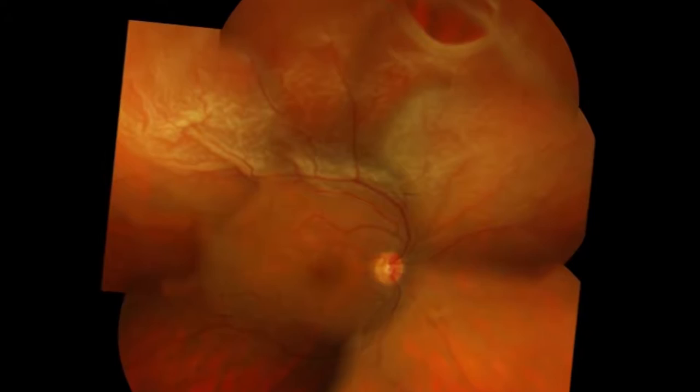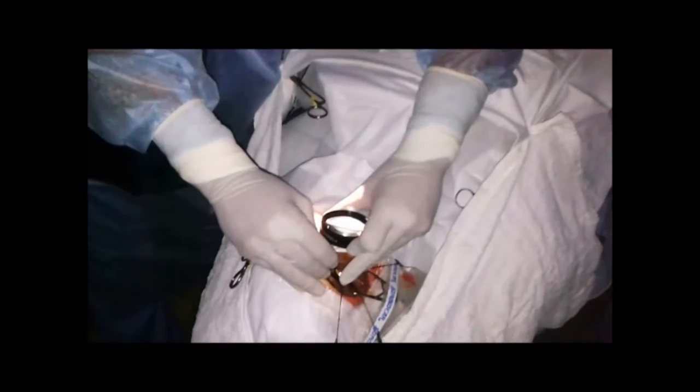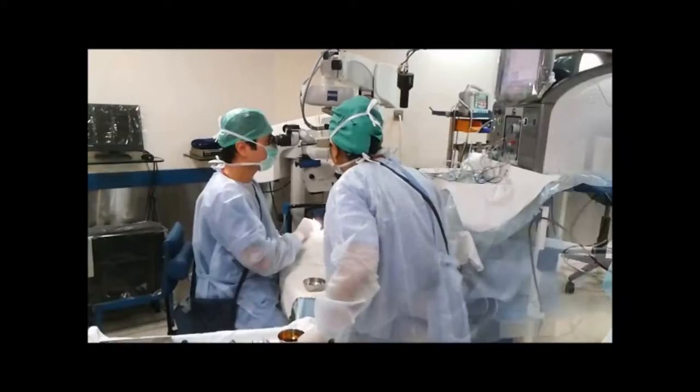Retinal detachment occurs due to a tear or break formation. Through the break, fluid collects into the subretinal space leading to a detachment. The classic surgery to treat this condition is buckling surgery, which requires the insertion of a plomb to indent the break. Traditionally, this procedure is carried out using an indirect ophthalmoscope and a 20-diopter lens, which can be quite cumbersome ergonomically.